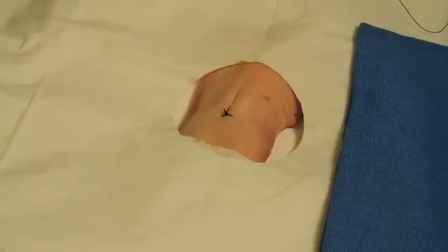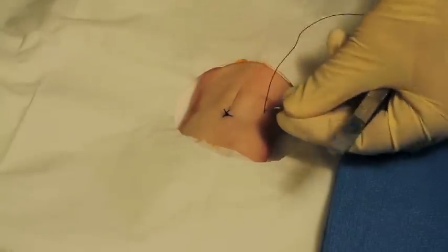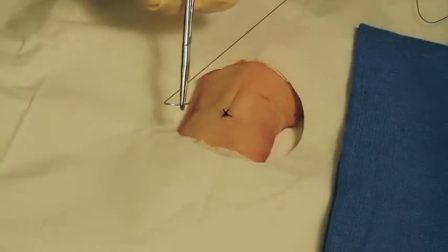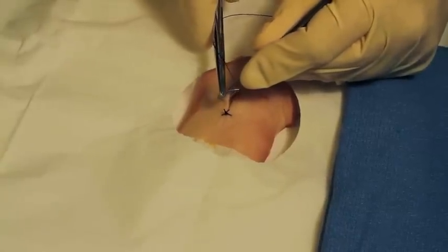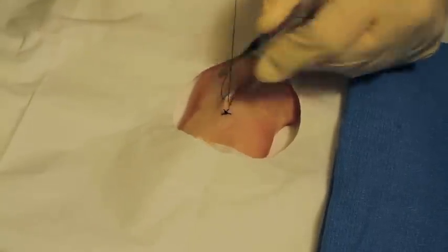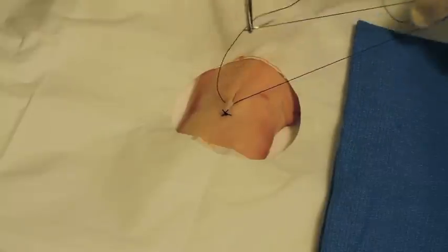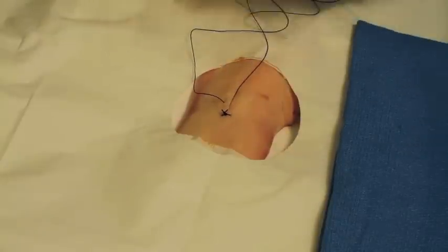You see that the skin is still apart, so you're going to want to put a second suture in this particular incision that we've made. Replace the needle right in the middle of the curve, grab your forceps, and drive with a twist of the wrist through the skin. Pull through — remember you want to save sutures, only want a couple of inches right at the very end — and all the way through.